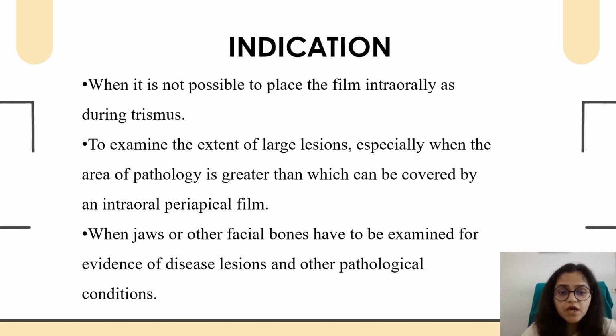opening of the patient, or to examine the extent of a large lesion, especially when the area of pathology is greater than what can be covered in the small IOPA film, that is intraoral periapical film, or when the jaw or other facial bones have to be examined for evidence of any disease, lesion, and other pathological conditions.